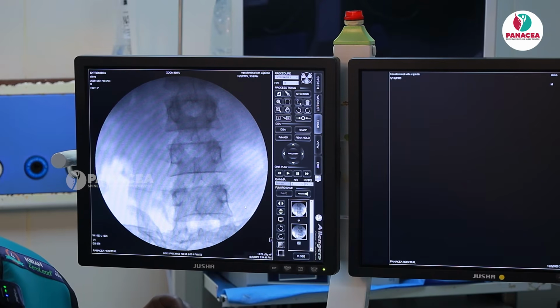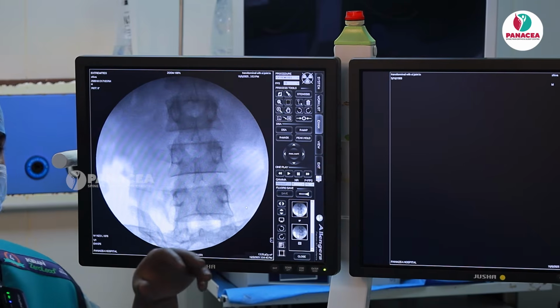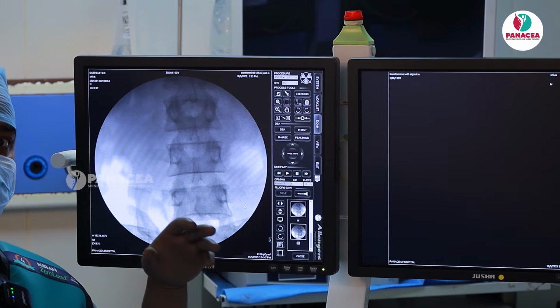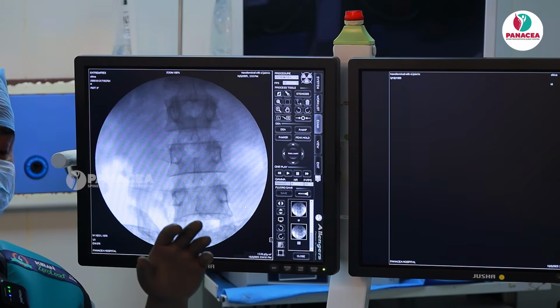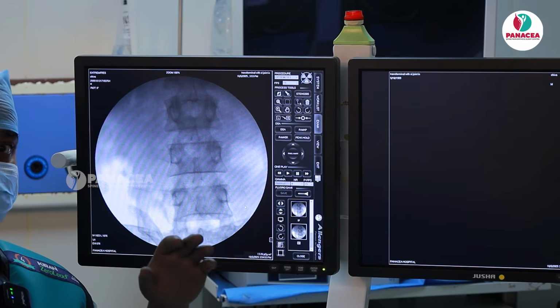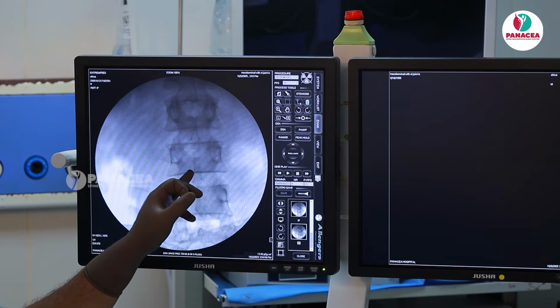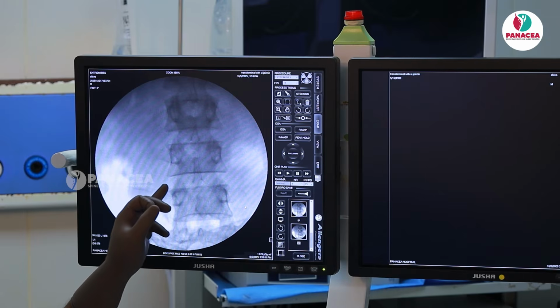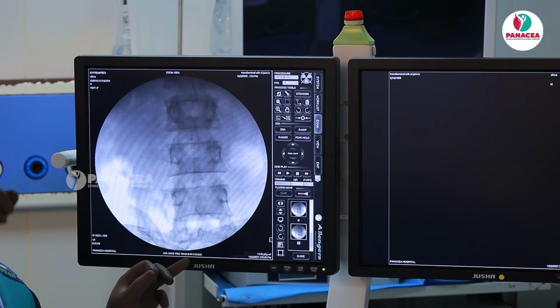of the fluoroscopy in order to get a Scottie dog appearance. Usually for L5-S1 and L4-5, we take almost 30 to 35 degrees. There is no hard and fast rule, it should be 30 to 35 degrees. The only thing is we have to tilt to such an extent that the spinous process, which is in the midline, is pushed to the opposite side so that it is in line with the SAP and IAP. That is point number 1.